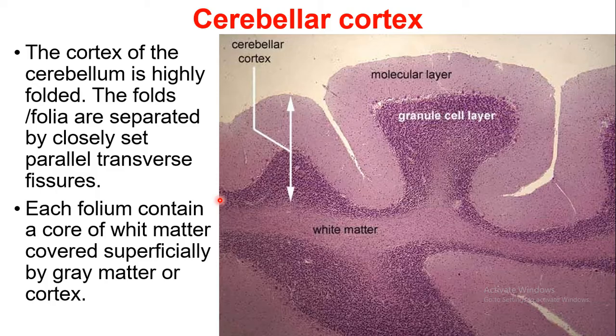Bismillahirrahmanirrahim. Today I am going to discuss the histology of the cerebellum. The cortex of the cerebellum is highly folded.